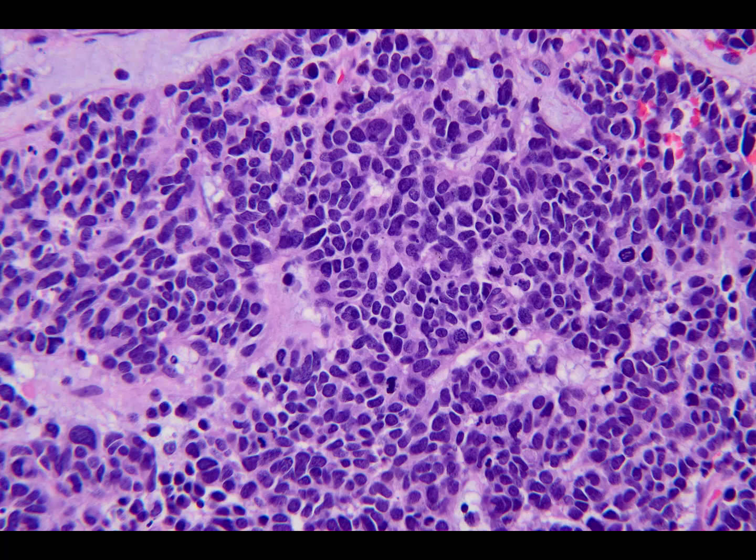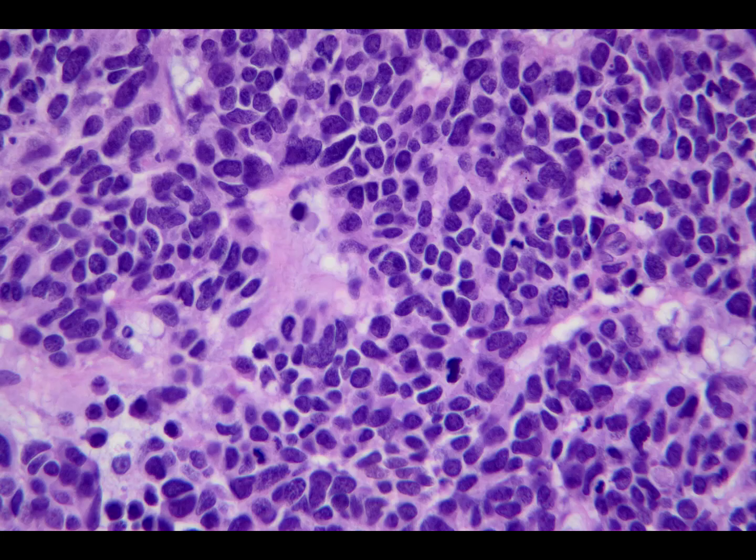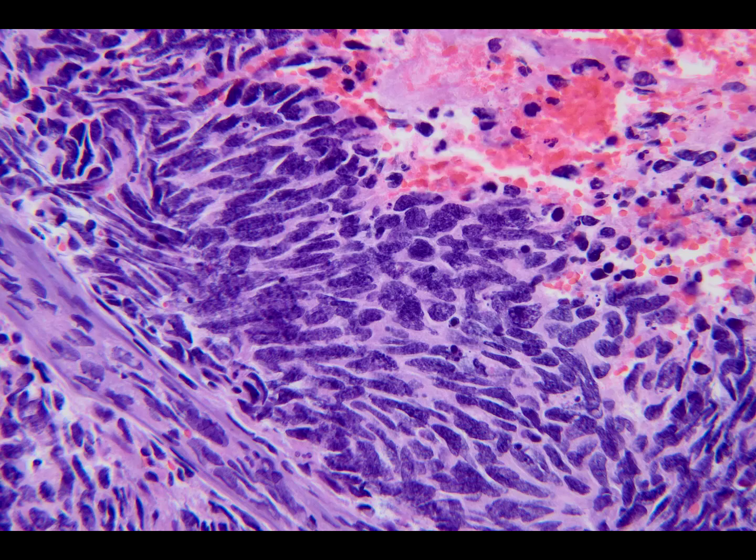The permanent sections show a population of malignant cells with irregular nuclei, scant cytoplasm, frequent mitotic figures, and apoptotic nuclear debris. Notice that the tumor cells have elongate and somewhat carrot-shaped nuclei. Importantly, the tumor cells lack prominent nucleoli. This helps to exclude a diffuse large B-cell lymphoma and a large cell neuroendocrine carcinoma.